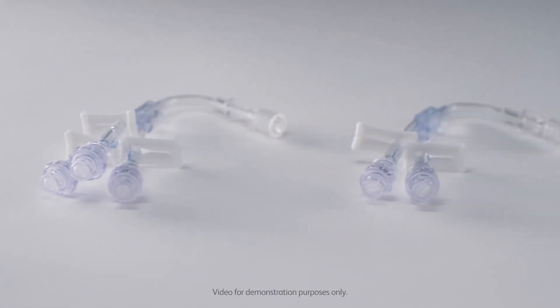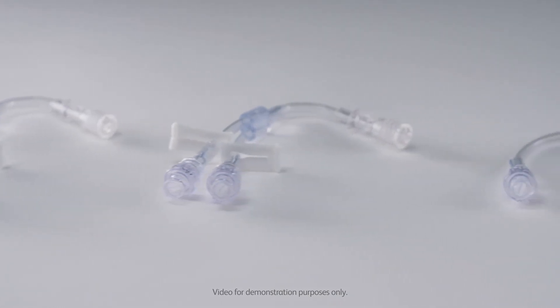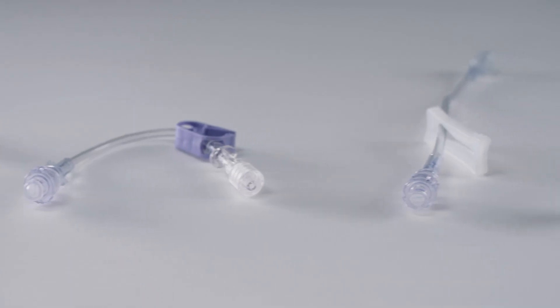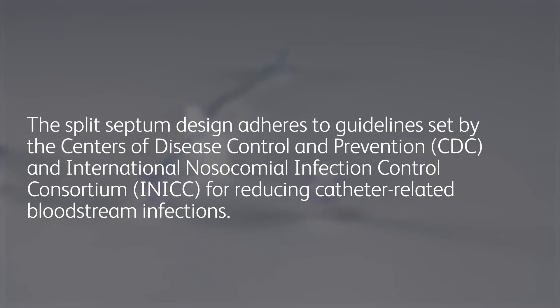The BD Q-Site is a split septum device that combines lure access with a split septum valve to provide a closed IV system. The split septum design adheres to guidelines set by the Centers for Disease Control and Prevention (CDC) and International Nosocomial Infection Control Consortium for reducing catheter-related bloodstream infections when used in conjunction with clinical best practices.